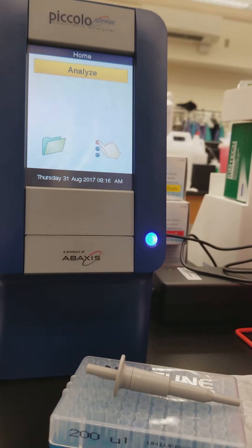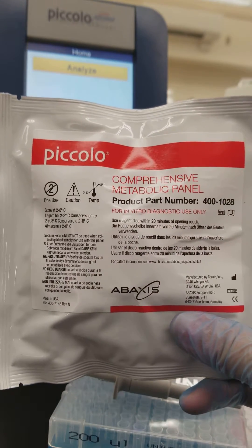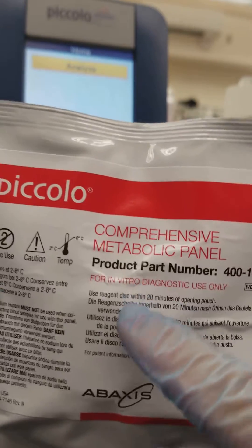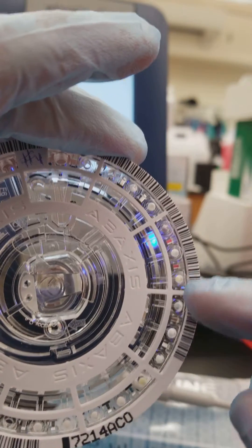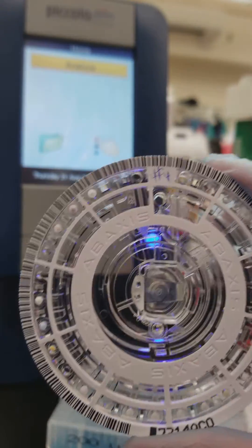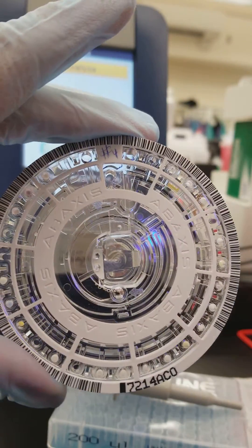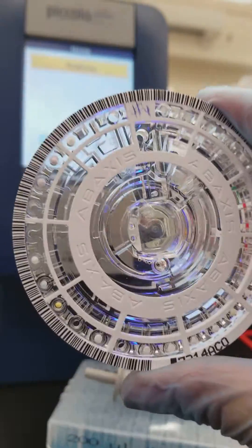When you pull these reagent discs out of the refrigerator they are able to be used right away; you don't need to bring them to room temperature. Just note that once you open this foil package you need to use it within 20 minutes. There are powder reagents on the outside and they are light sensitive, because this analyzer uses a spectrophotometer inside to shine light through this disc and measure the light absorbance or reflectance when measuring the actual analytes.